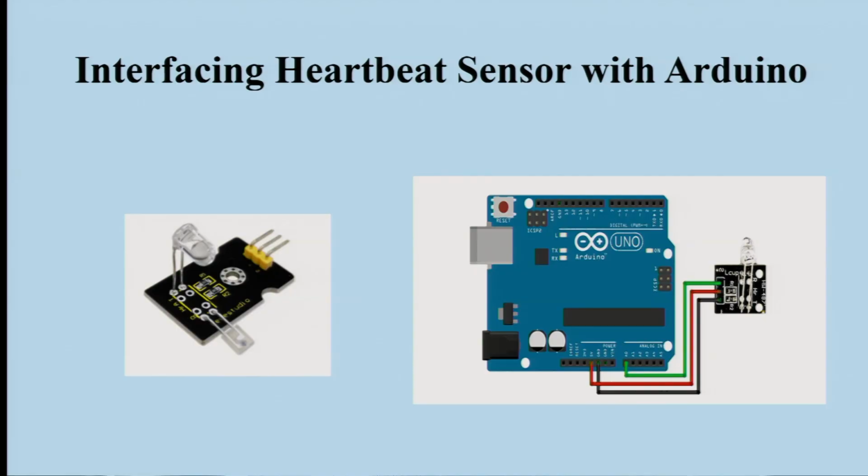This is a very minute experiment, although yes, this is going to be a huge concept if you are going to work in any medical domain with your IoT concepts in future. First of all, you can see on the screen that we have a simple sensor. I have used a Keyes sensor over here. This company keeps on designing a variety of sensors and this is one of the basic sensors they provide to sense your heartbeats, or we can say pulse rates, from the fingertips.